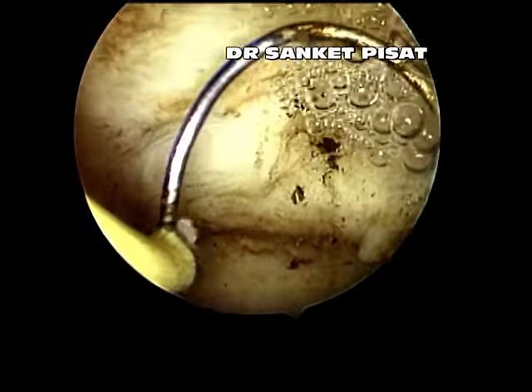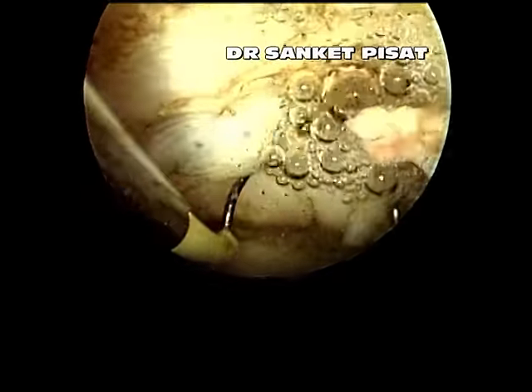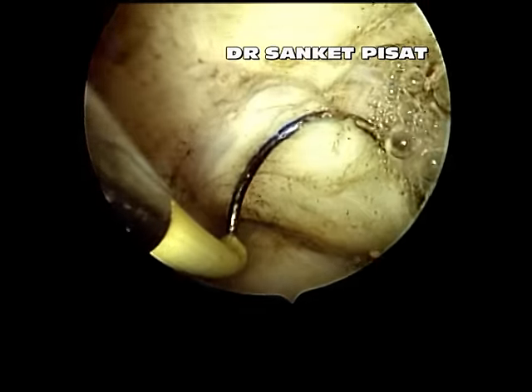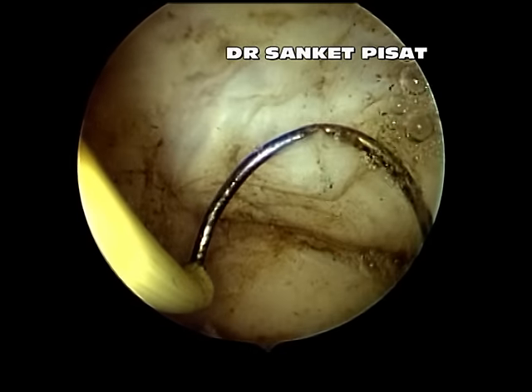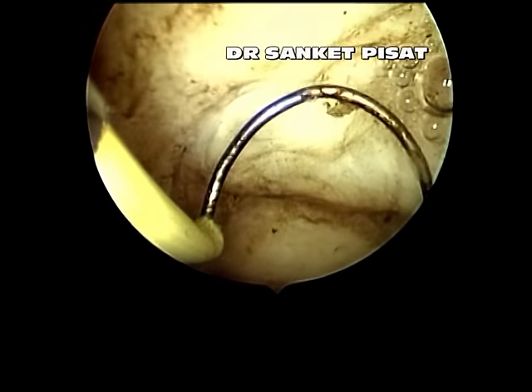Next, using a cold loop dissection technique, an attempt is made to push the fibroid away from its attachment to the normal myometrium. This displacement is sometimes towards the surgeon and sometimes away from the surgeon in a gradual effort to shift the fibroid away from its original position.